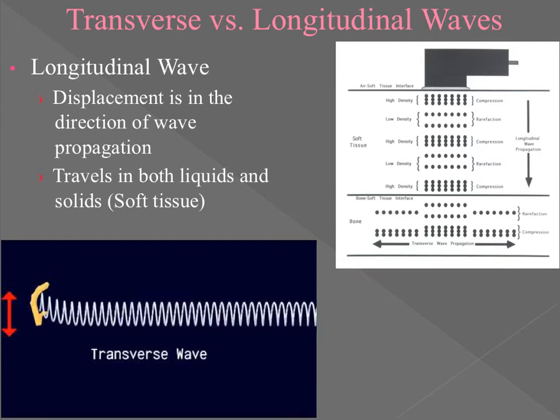Okay, so in therapeutic ultrasound, we really have 2 different waveforms, and these waveforms become extremely important to understand, right? Because it's the way in which the molecules are displaced. And that's important because remember, molecular displacement leads to what? The ultrasound waves being able to penetrate and then to be absorbed by the deeper layers.